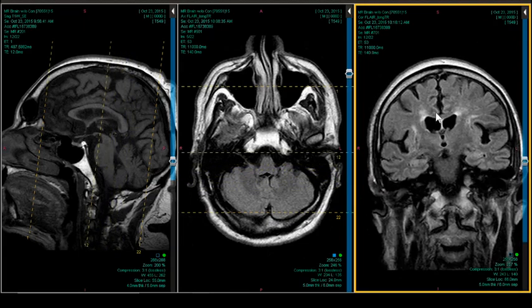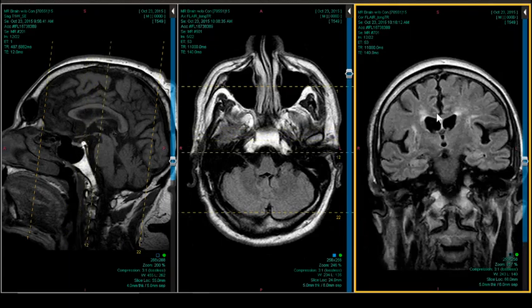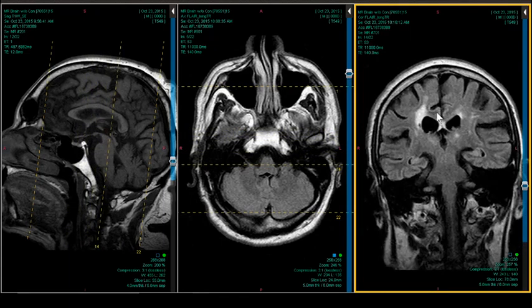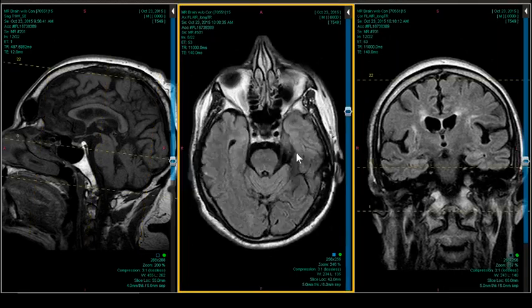I would not mention MS in a 70-year-old with that clinical history and with this pattern. It's not a good pattern for MS. It's not right-angle demyelination, and it's pretty confluent, and it's not temporal. Right.